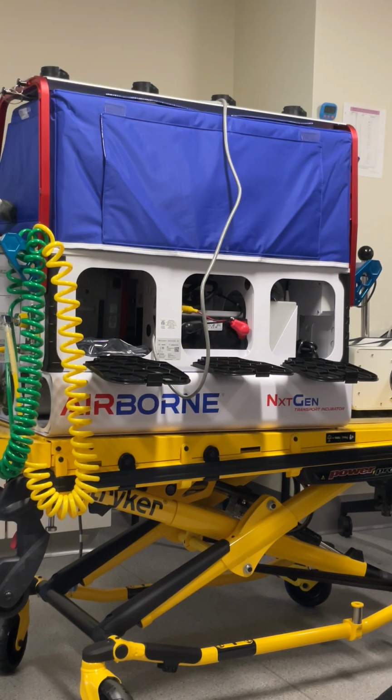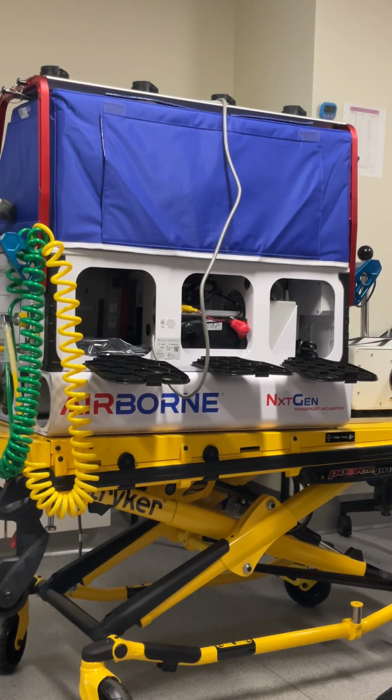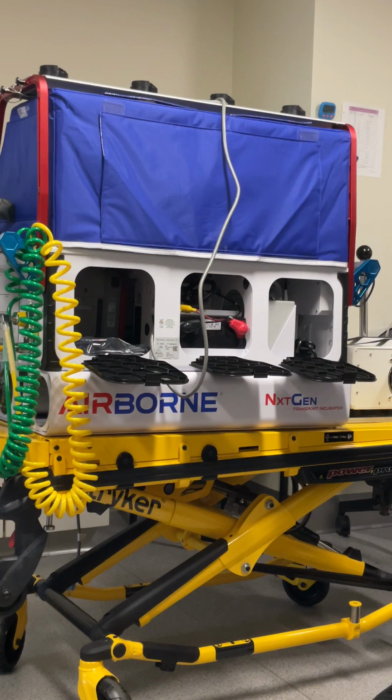I know you guys have a lot of pumps you're bringing, so you're probably still gonna have to splice something to get that amount of power if you want it all hooked up. If you don't find unplugging it, then you probably still have plenty of power. No, we got enough. Okay.